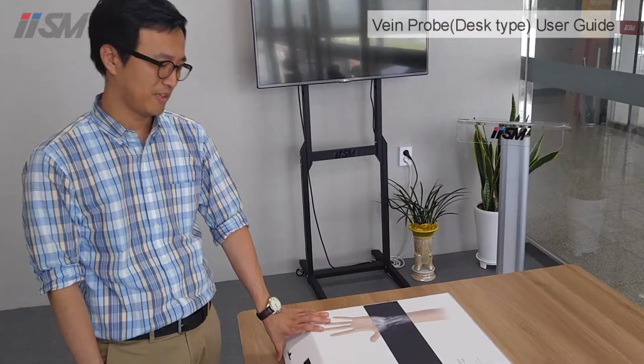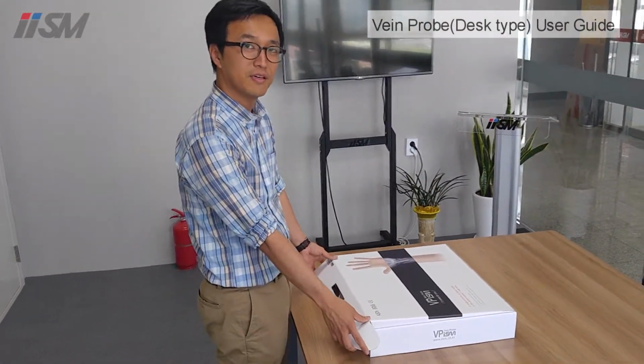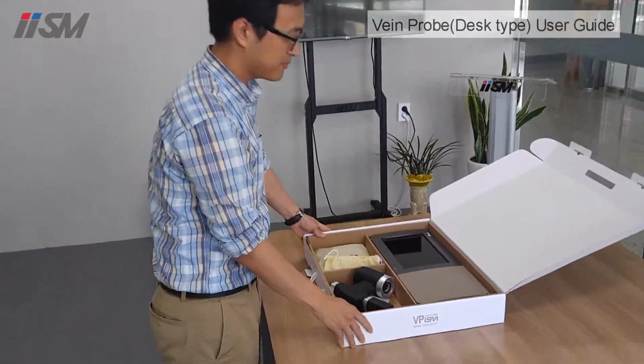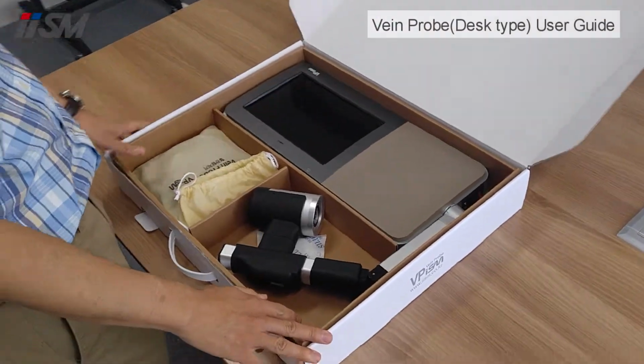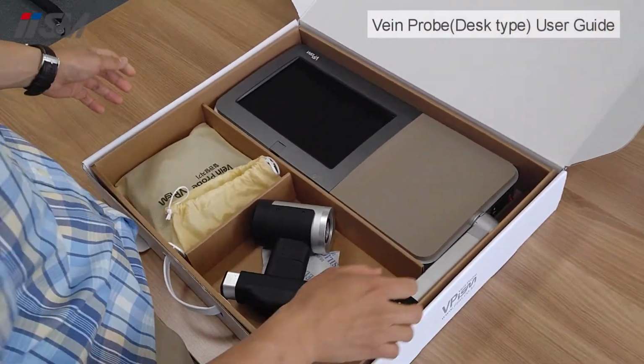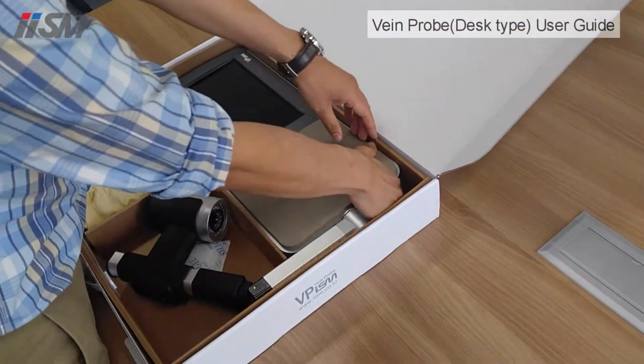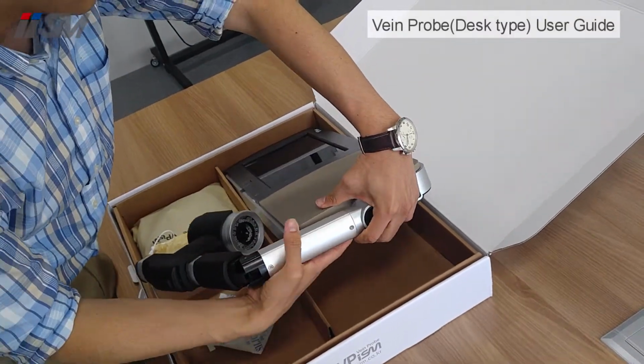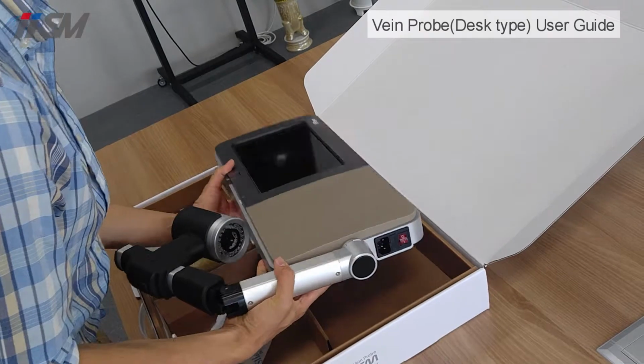Khan, and today I'm going to tell you about how to install and how to use the VeinPro desk type. So first of all, you open the box, and here you can see the desk type. First of all, you take it out carefully. Be careful to hold the LED stand while you take it out.